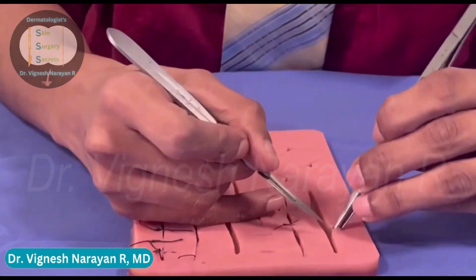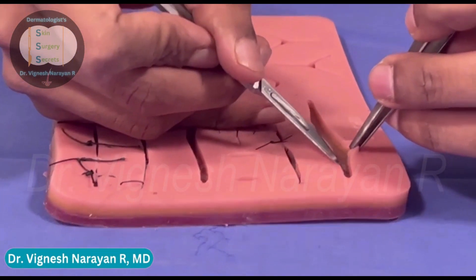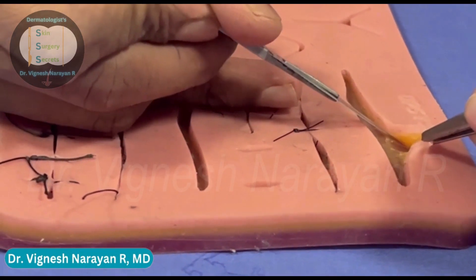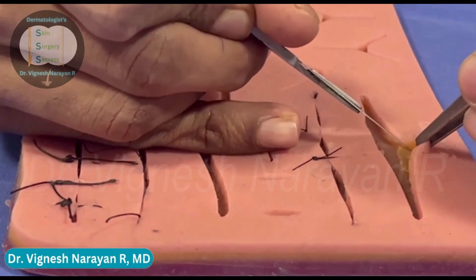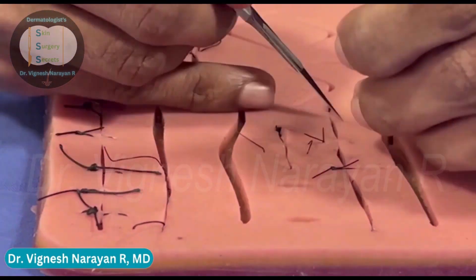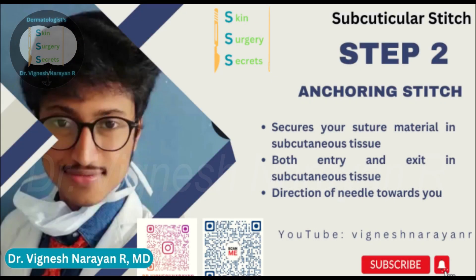Good morning. I'm going to be talking about subcuticular suturing. First, you need to undermine the edges. Undermining is done to create a tissue plane so that you reduce the amount of tension while suturing. You just lift up the tissue and pass your blade gently to create a plane. You don't have to overdo the undermining — just enough to get a tension-free closure. Here you can see I'm creating a uniform plane throughout the wound edge.